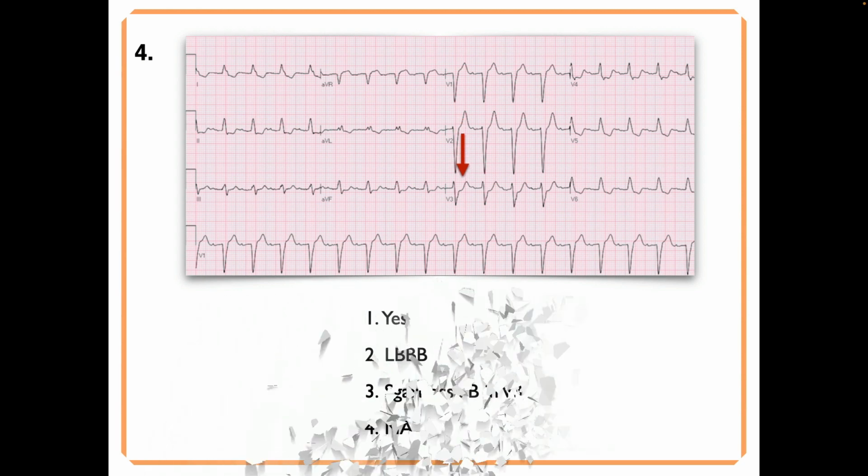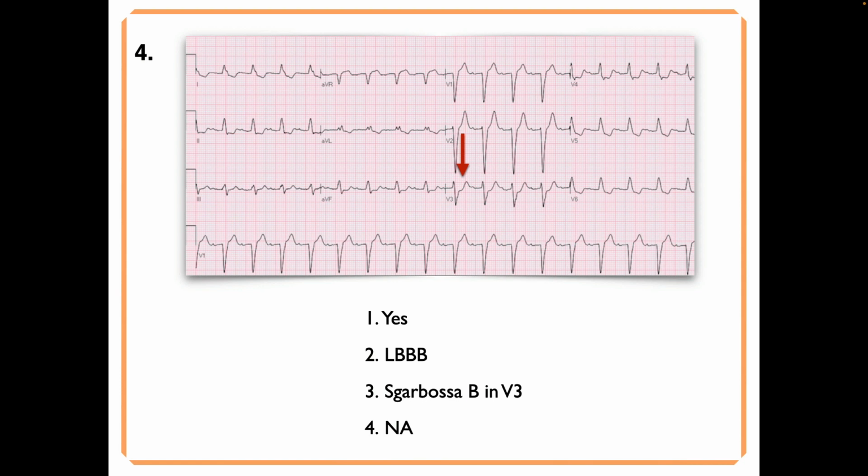Now, here are the two mistakes, and I'm going to point this out a couple of times. The two mistakes that people make with Sgarbossa, you can see it's pretty straightforward. Number one, they forget. And I can't help you with that. You just have to study and remember.